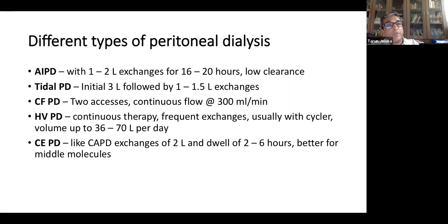The concept is when you do a CAPD or APD, the conventional one, the fluid goes in and the entire fluid comes out, and then again you refill the belly with new dialysis solution. What happens is during the removal of fluid and entry of fluid into the belly, there is some time where peritoneal membrane is not sufficiently in contact with fluid, so no transfer occurs, so we miss out on that time, right?